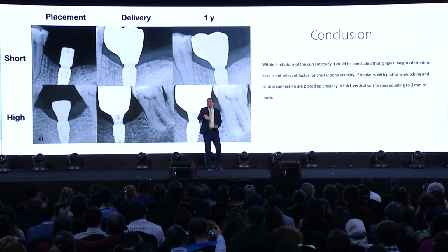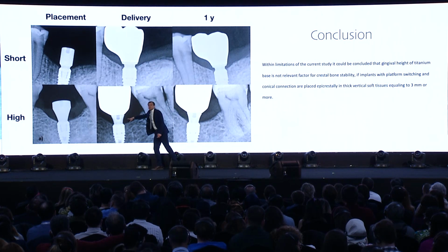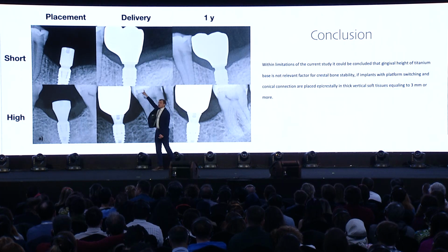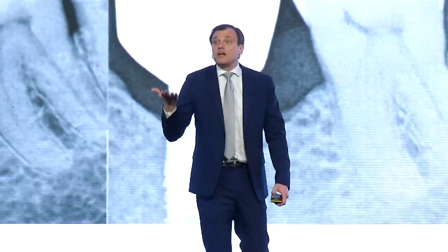Now, if the implant goes deeper, surely the deeper the implant is placed, the more tie base height is important. So if this implant would be, I don't know, 1 millimeter below the bone, surely I'm not going to use low tie base. I'm going to use higher tie base. And if it even goes deeper, then the height of tie base becomes increasingly important.